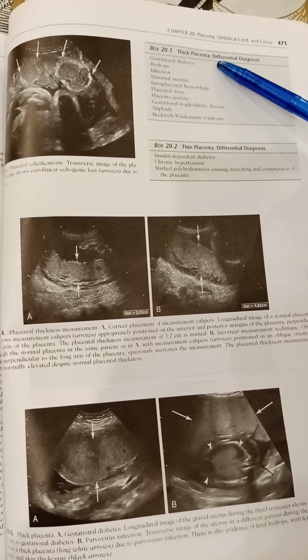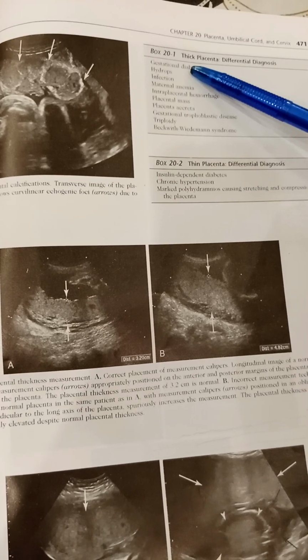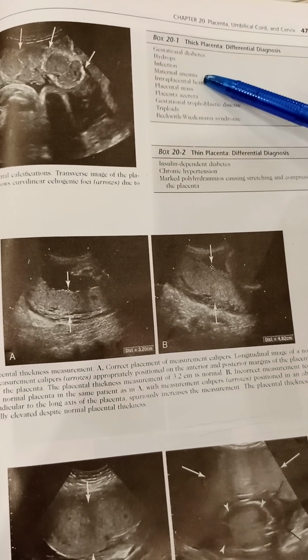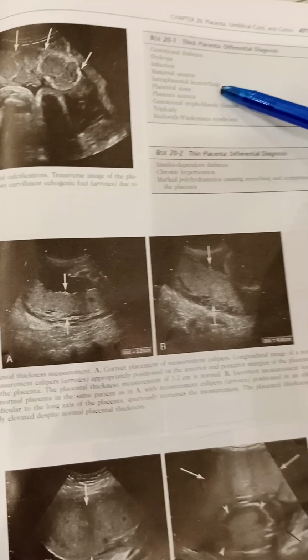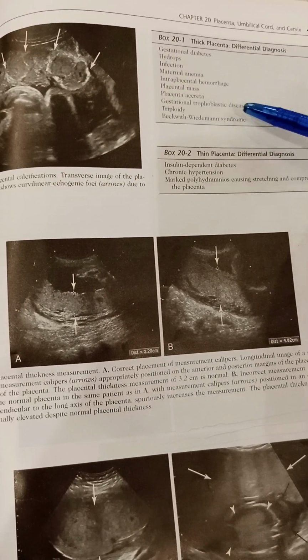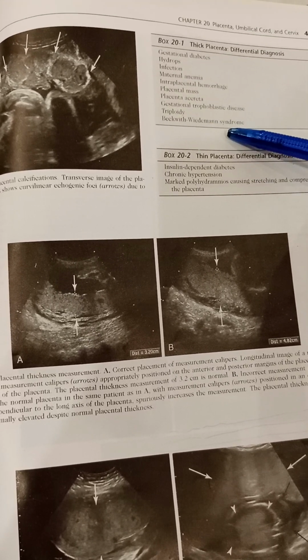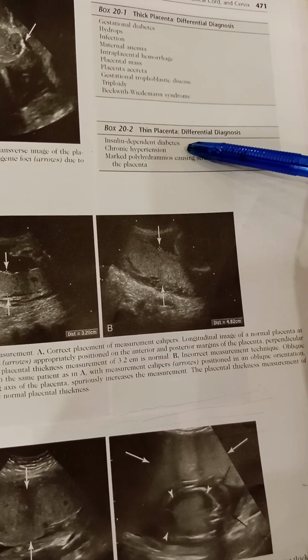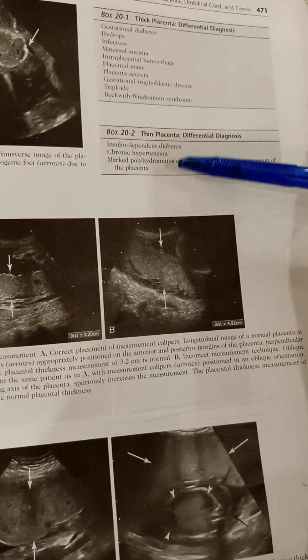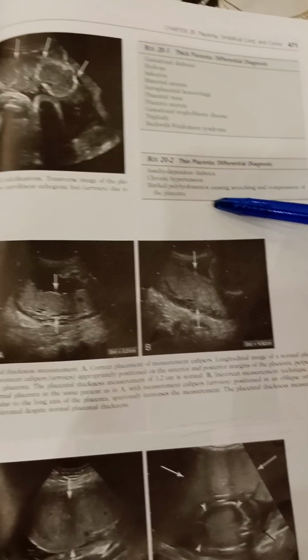The thick placenta differential diagnosis is gestational diabetes, hydrops, infection, maternal anemia, intraplacental hemorrhage, placental mass, placenta accreta, gestational trophoblastic disease, triploidy, and Beckwith-Wiedemann syndrome. The thin placenta differential diagnosis is insulin-dependent diabetes, chronic hypertension, and marked polyhydramnios causing stretching and compression of the placenta.